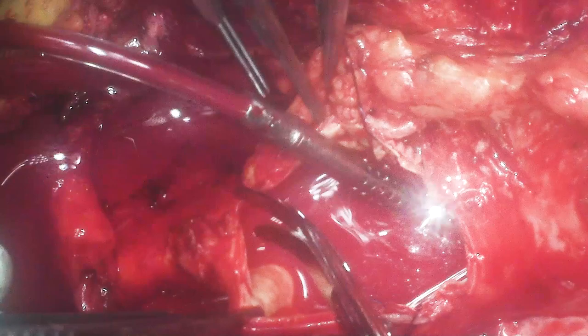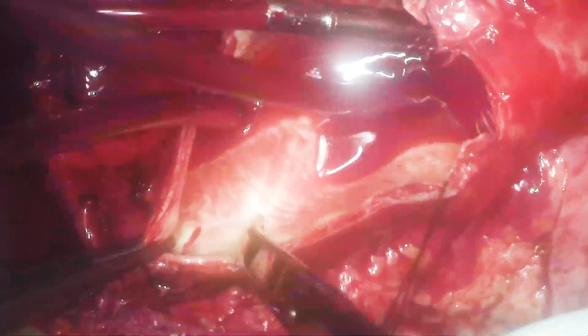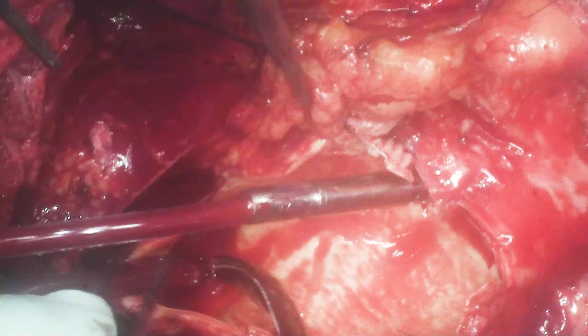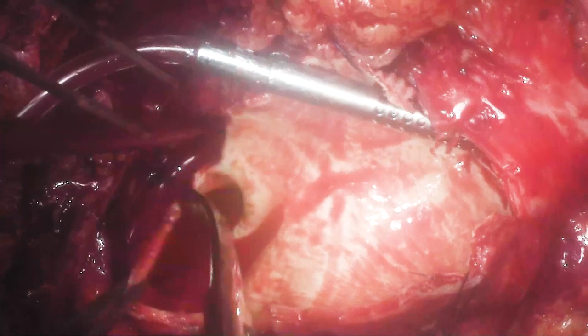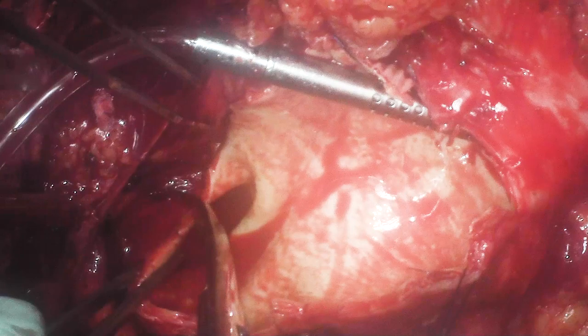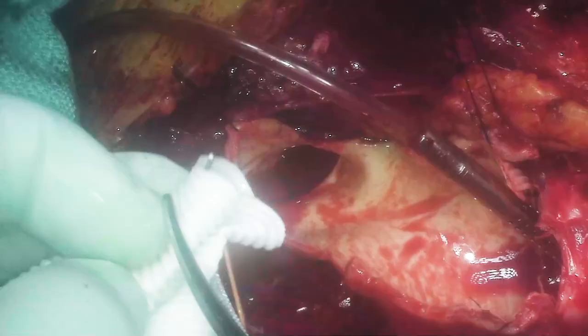Here I'm opening up the arch and beginning to plan how we're going to do the operation. Note that we set up here so we can use an inclusion type of technique — we'll be able to use the aneurysm wall to wrap around the new graft. You'll see the innominate, the carotid, and the subclavian arteries more distally. It's important that you don't suck blood out of the descending aorta — try and keep as much blood in there as possible, otherwise you risk getting air embolism to the viscerals.